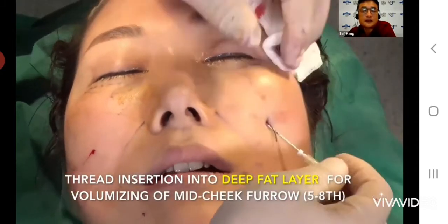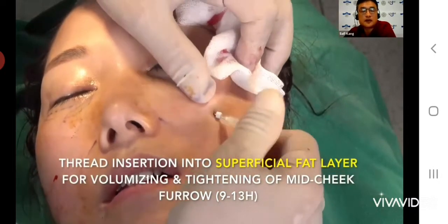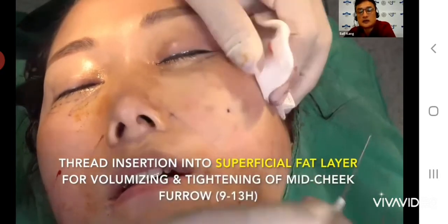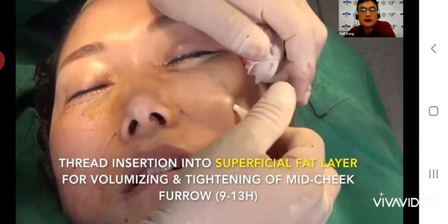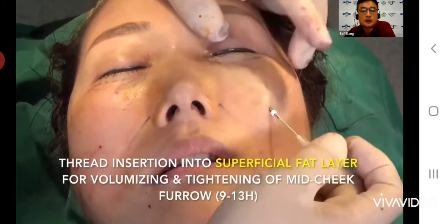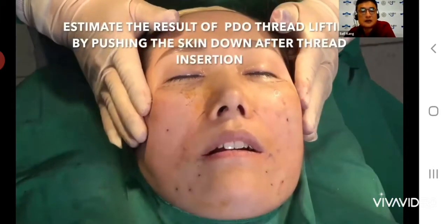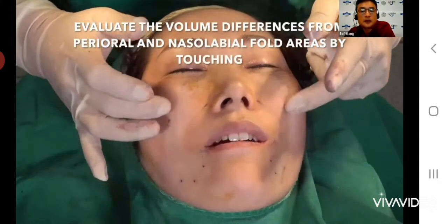Okay, a very easy technique. When you insert the thread, you should touch the maxillary bone first. Place the thread under the maxillary bone, at least 3, then 3 or 4, and then you can insert the thread under the muscle, in the middle deep fat layer, and finally under the skin. The defect in cross-section view of this dead space is not a square or a triangle, but you can imagine the dead space inside. So you can control the number, and you can control the level of thread insertion.